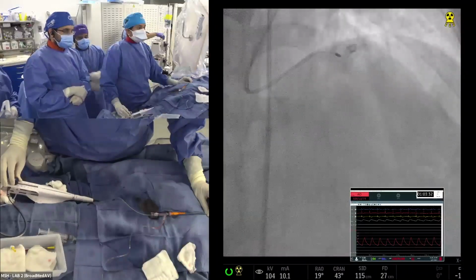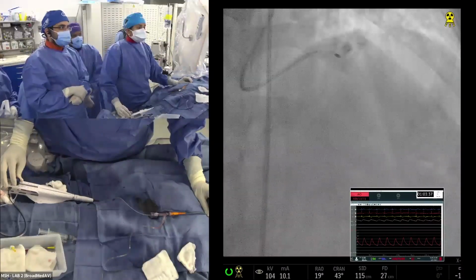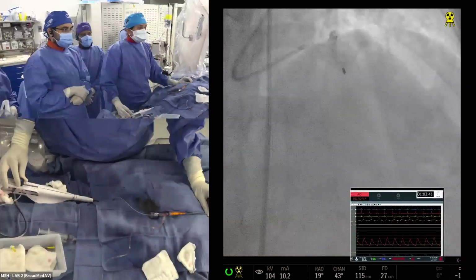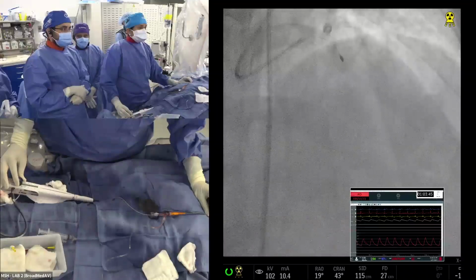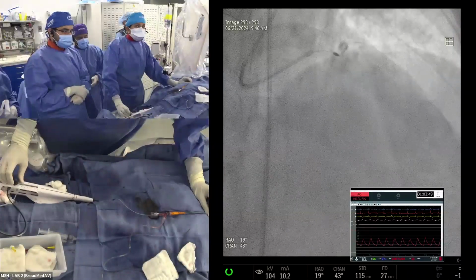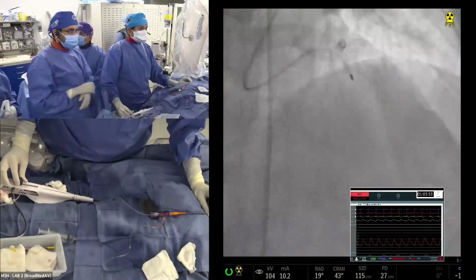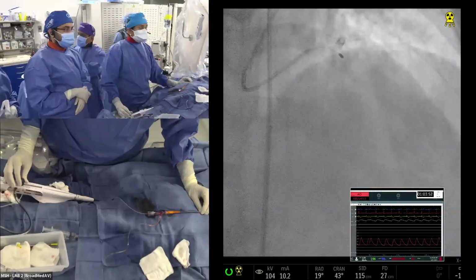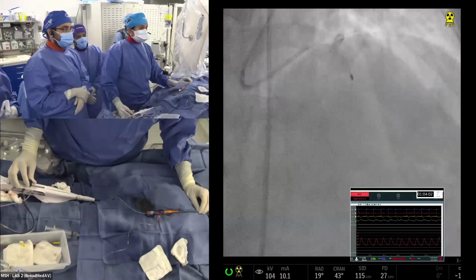What RPMs are we using, Dr. Samin? All 150,000. Remember the RotaPro, which I set up. This is the device. I went to their plant and set it up to our liking, so that it comes up at 150. You don't have to adjust anything. You go on, take it out, and it will be at 150, 155. You can increase or decrease as you choose, but it comes factory set at 150, 155. And that is what we use in most cases.